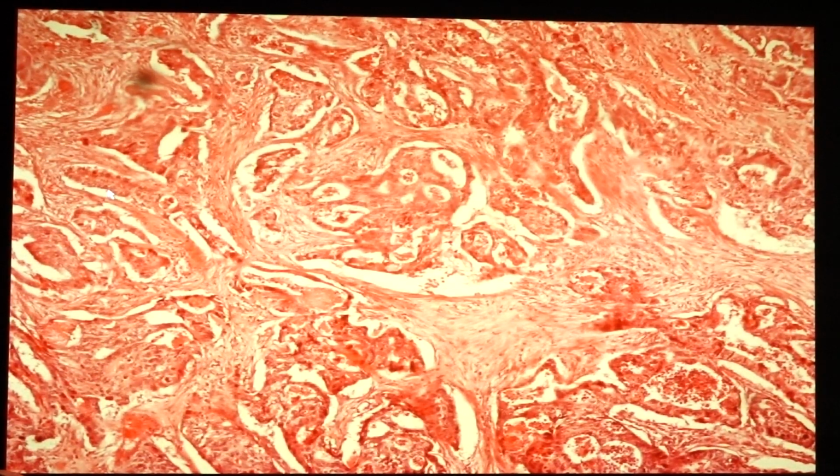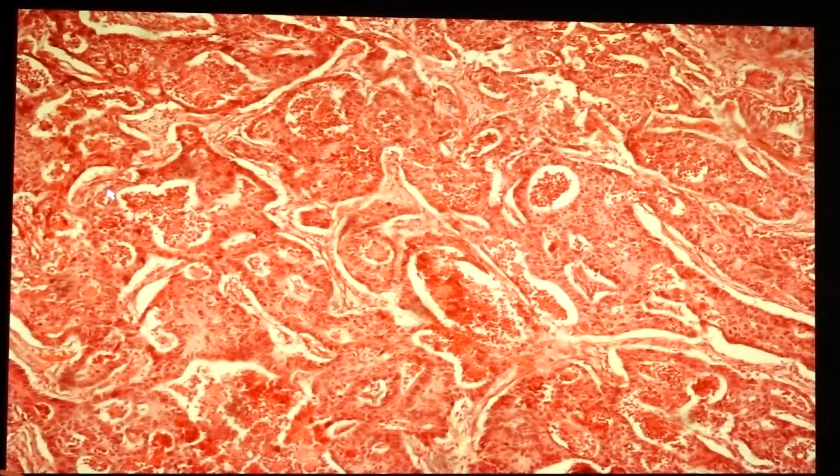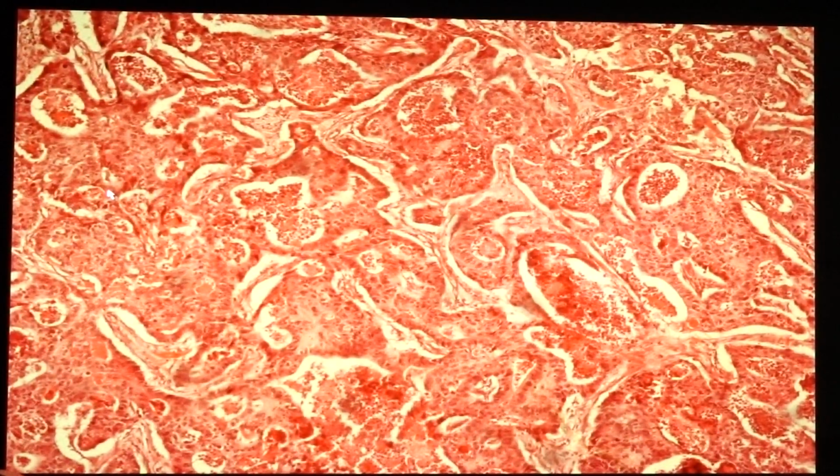With regards to the genetic mutation, sorry for the dimming and increase in the light of the microscope. It is associated with the APC gene mutation, that's loss of function, and the beta-catenin, that's gain of function mutation. So this is seen with the sporadic intestinal type. When you say sporadic intestinal type, we would see the presence of glandular patterns like this. So this is of the intestinal type.